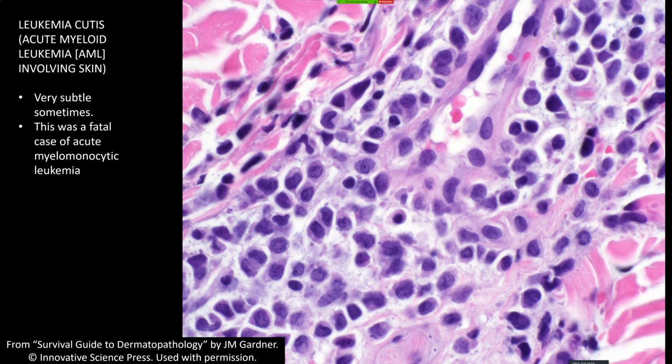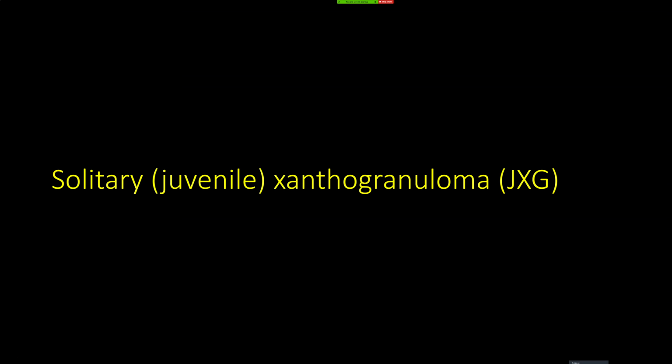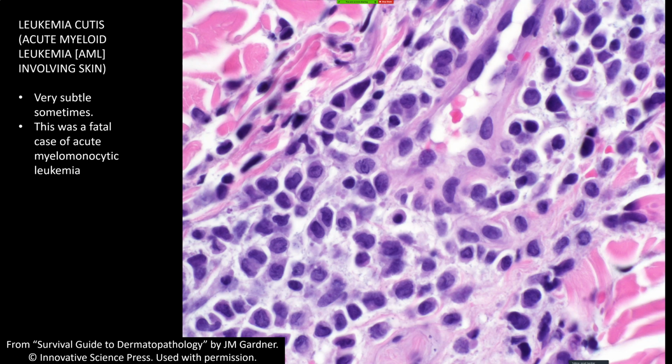All right, and here's a closer look at these myeloid blasts in this case of AML. Okay, any questions about AML before we move on? Okay.